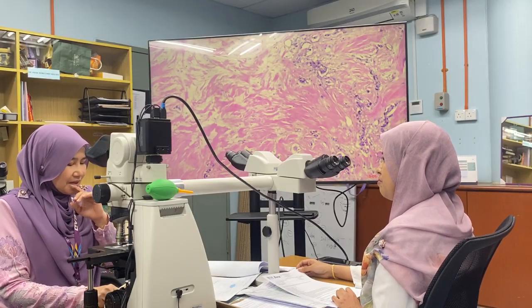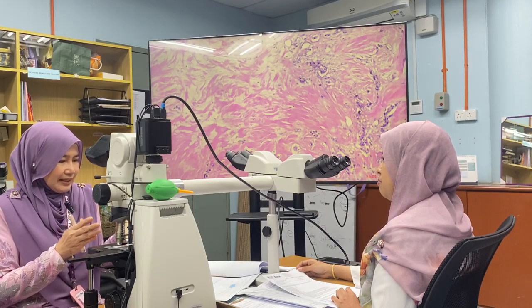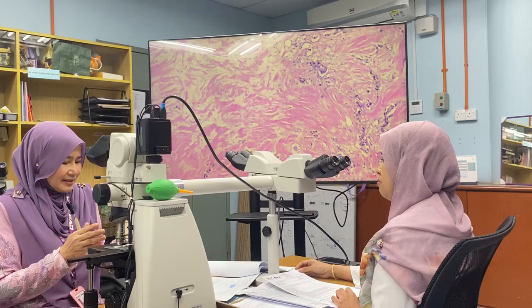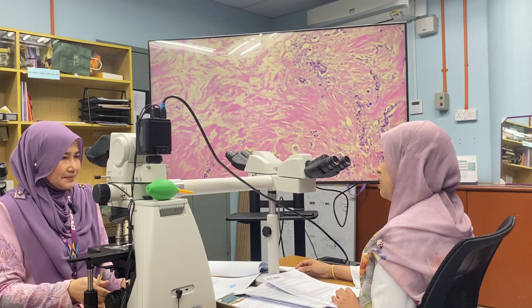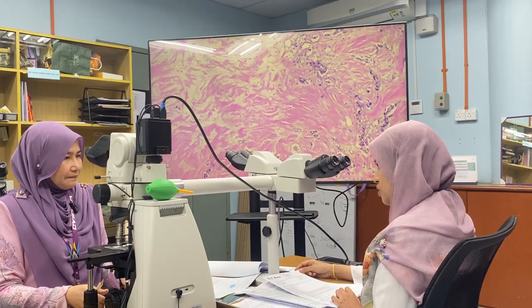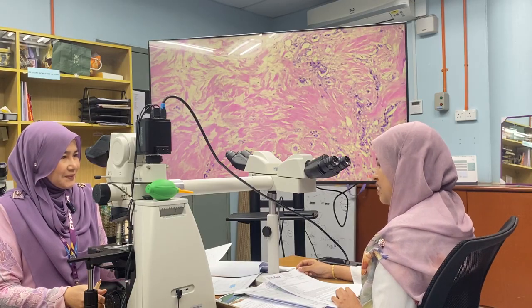So, do we need to assess those changes only in the tumor bed, or is there any other area that we need to assess? We need to focus on the tumor bed, but then also the rest of the breast tissue. What about the lymph node? Yes, lymph node also.